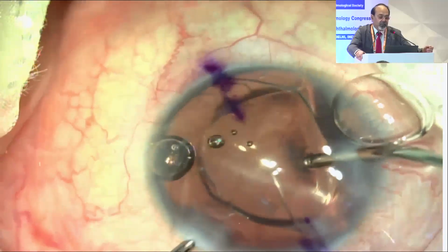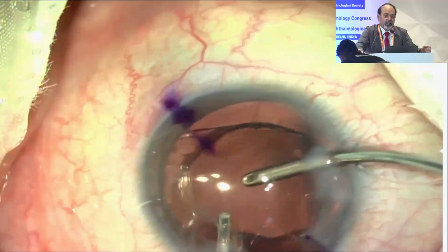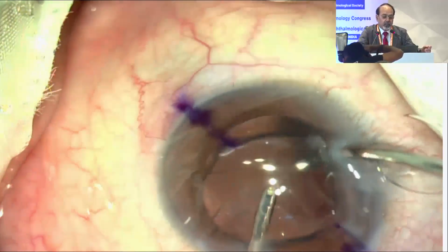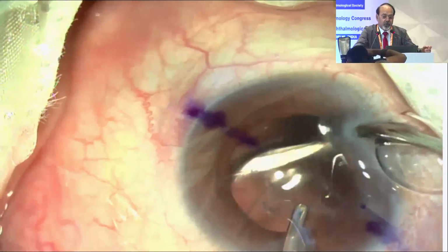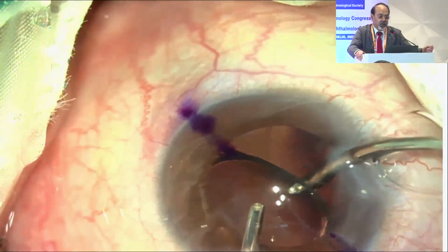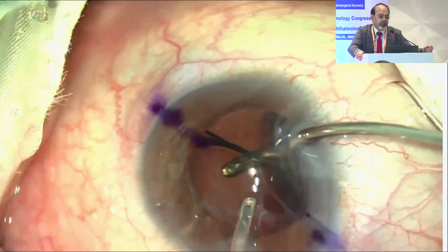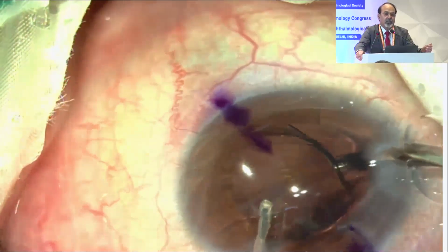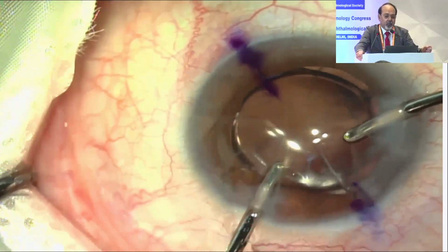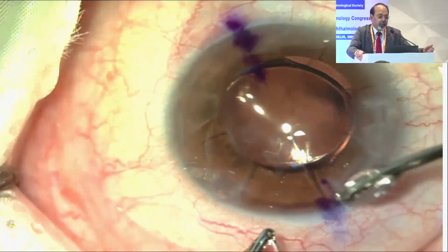I never did anything more than 8 incision radial keratotomy in my life, which was almost 10 years. I might have done about 150,000 radial keratotomies. But these incisions are pretty strong once you have kind of taken almost 10 years or so. After that, there is no problem. These incisions do not give way. The only thing is, once you have manipulated so much, there will be some disturbance in the incisions, and these incisions will gradually heal once again and go to a little bit of hyperopic shift. So you have to take care of that while you are doing the cataract surgery.